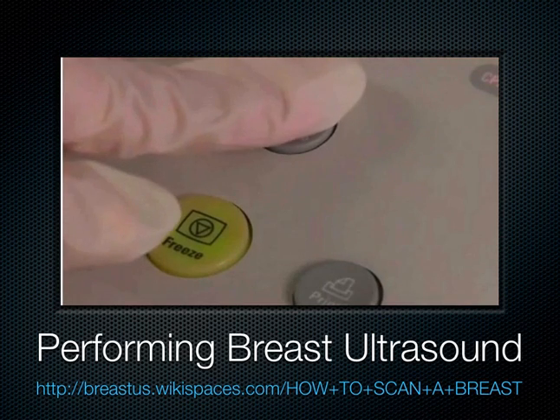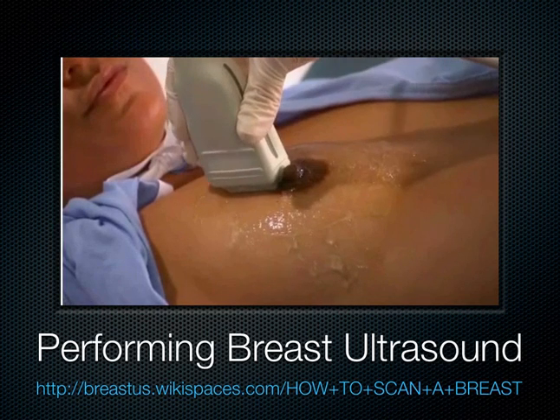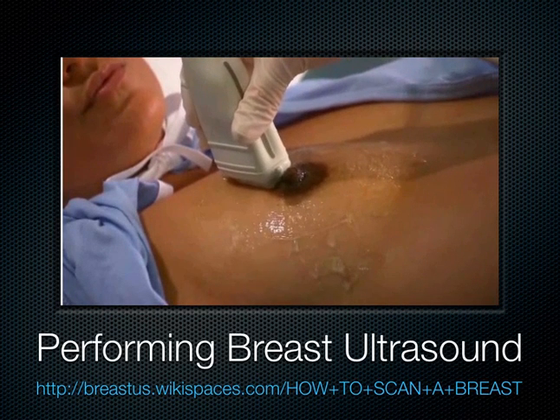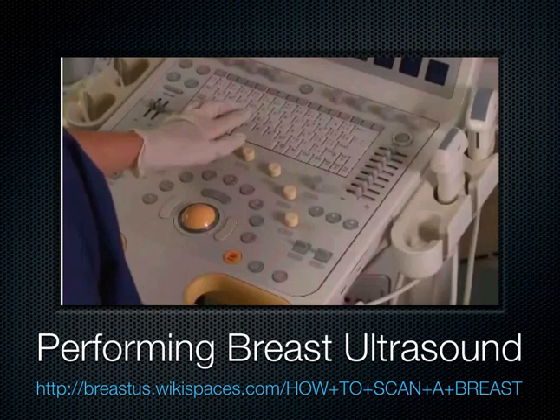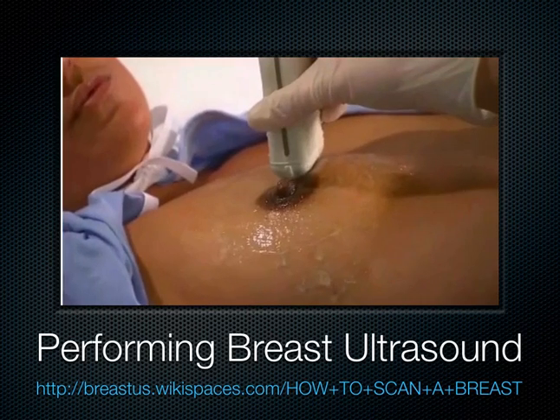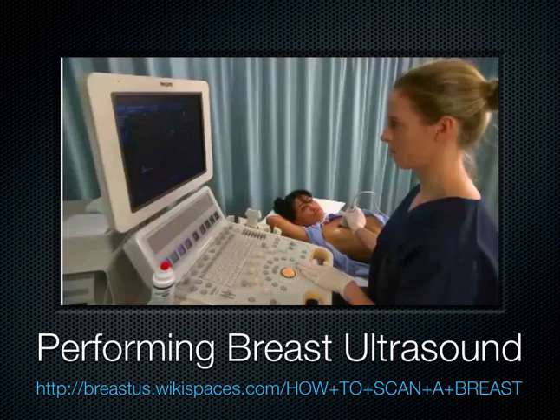Save the image. Unfreeze the image and then scan the breast by rotating through every clock position in a clockwise direction towards 6 o'clock. Freeze, annotate, and save the images at 1, 3, and 4 o'clock.